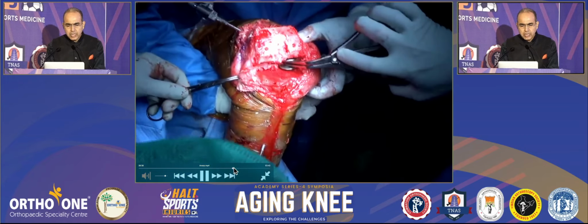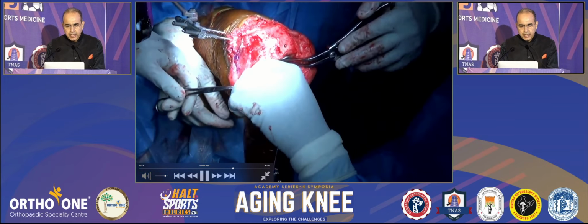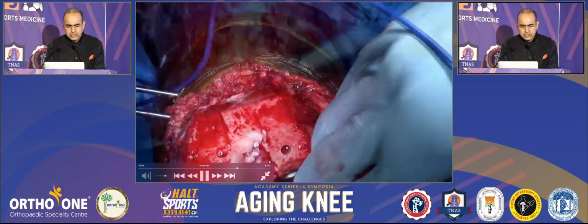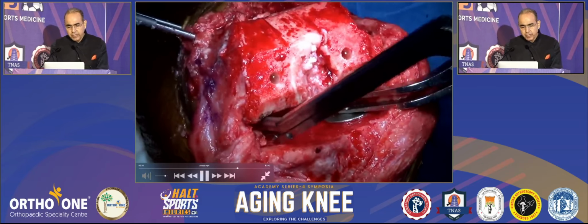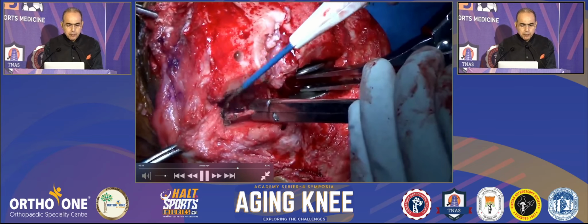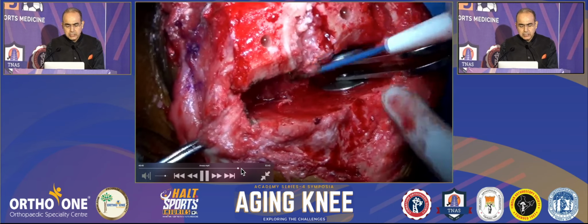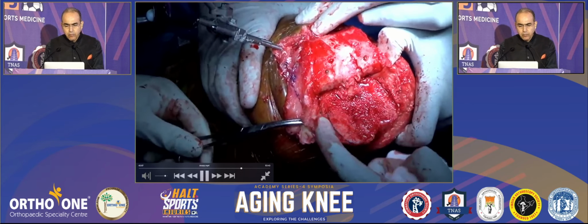Now we use a laminar spreader, remove all the osteophytes medially and posteriorly, and do not do any ligament release, including the PCL and the retinacular ligaments. Once all that is done, we see a trapezoidal gap in flexion. This is very important. The normal trapezoidal gap is maintained with kinematic alignment because you are not taking off the PCL, you are cutting in varus, so your normal trapezoidal space in flexion is maintained, which will allow for a nice rollback.